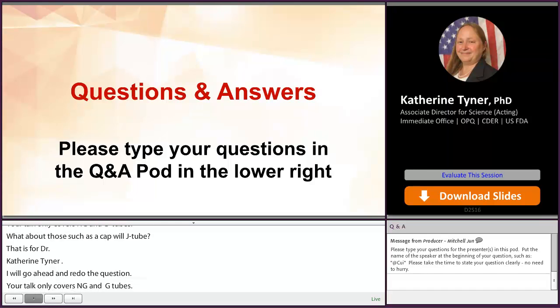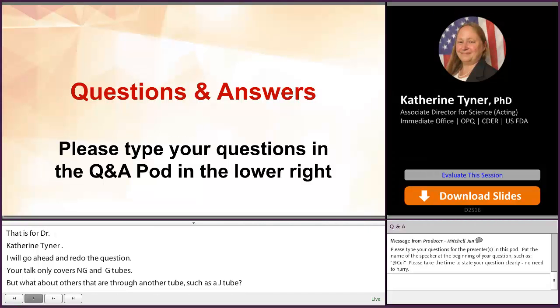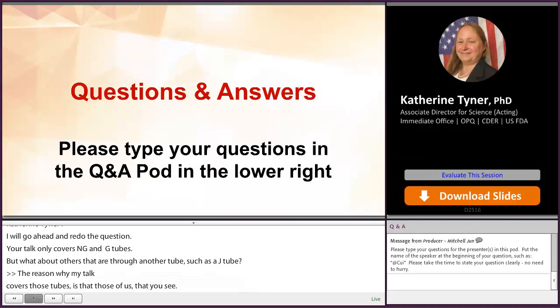Great, thanks. That's another great question. So the reason why my talk covers mainly the NG and G tubes is because those are the ones that we most commonly see. However, if the label did say to administer through another type of tube, such as a J tube or an NJ tube, please follow that and use the same type of criteria and the same testing recommendations for those tubes.